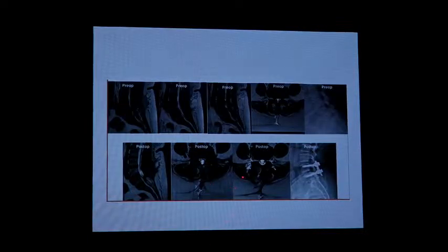Similarly, one more patient, and you can see that we have gone through a unilateral midline laminotomy with adequate decompression. This is a pre-op, this is a post-op, there's a good decompression, very minimal muscle injury. Patient has done well. You can do single level and 2-level TLIF too. It all depends upon how comfortable you are. It can be done through the same procedure. This is a post-op X-ray at 2 years showing a good bony fusion.